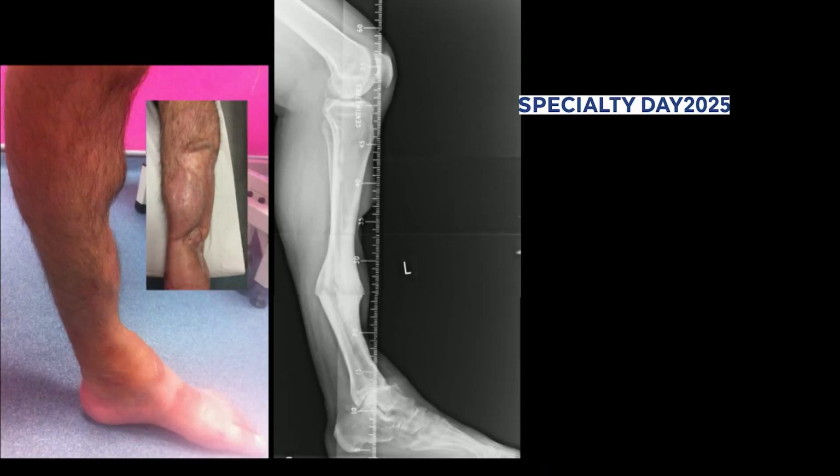Here is another case, and slightly more sort of interesting in the sense that this gentleman had this posterior apex deformity. And you would know from that table that the compensation for this would be an equinus deformity. That is not obvious here at all. If I said this is an equinus, you won't believe it. But the clue is this sort of anterior subluxation, and it's becoming arthritic.